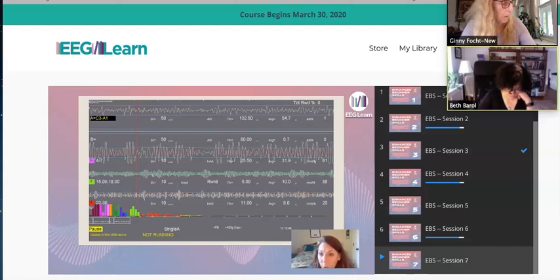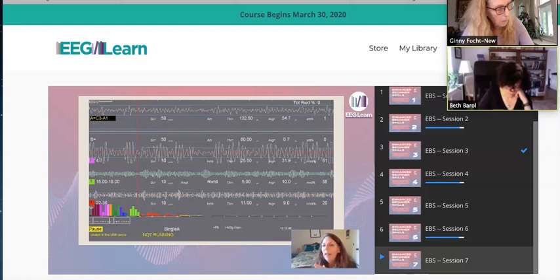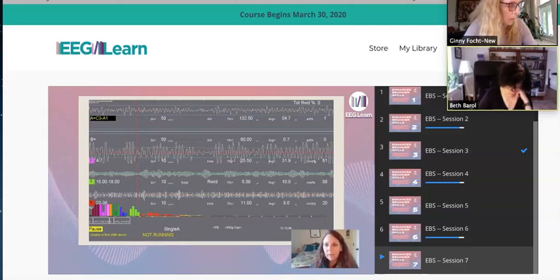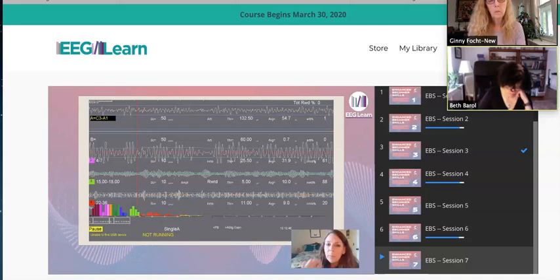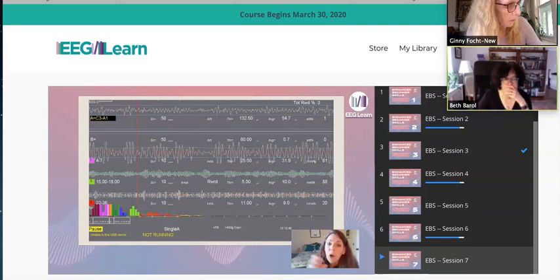The opposite is true for your inhibits. If there's a higher percentage on your inhibit band, that means that threshold has been set at a tougher challenge level. So lowering a limbo bar increases the challenge level of that game. Lowering a hurdle makes that obstacle easier to negotiate, right? Okay, so I'm pretty much making it easy for them to get a beep. A beep is going to be readily available as long as their slow wave is within range.